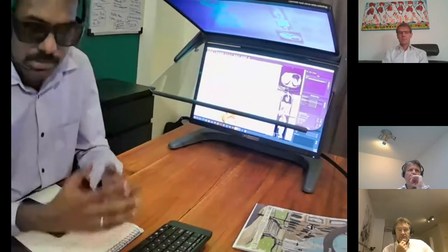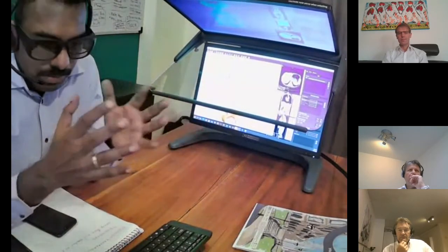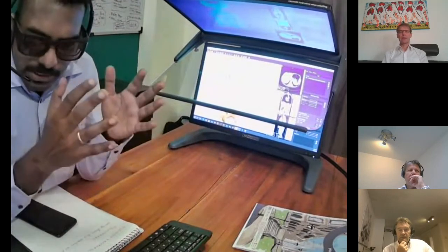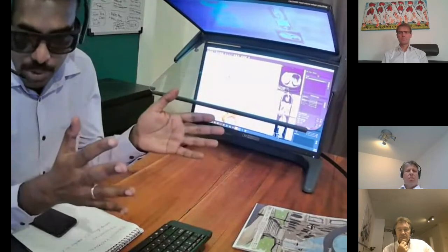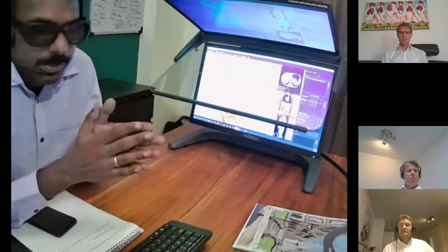There are a variety of options you can look into with 3D PluriView and Vesalius together. Vesalius is software which we can put into any computer system. The only requirement from our side is a graphics card.